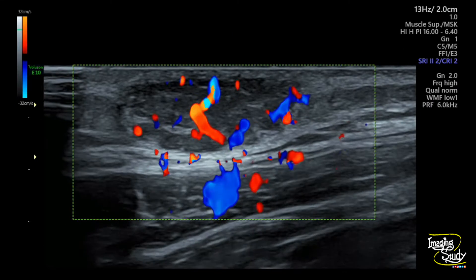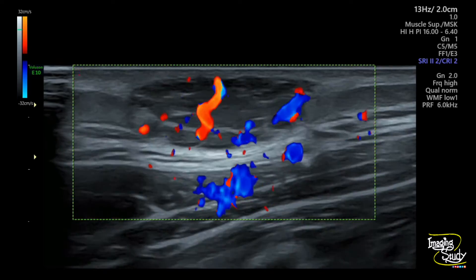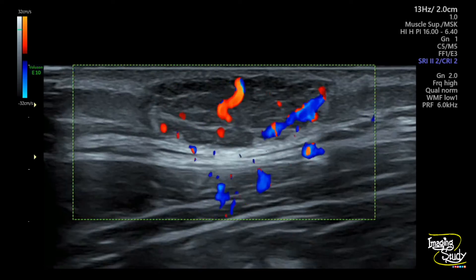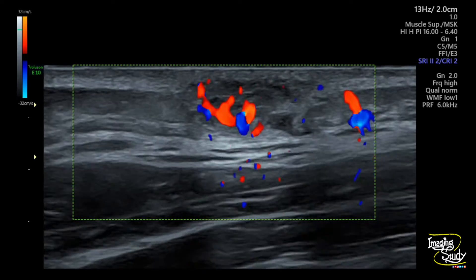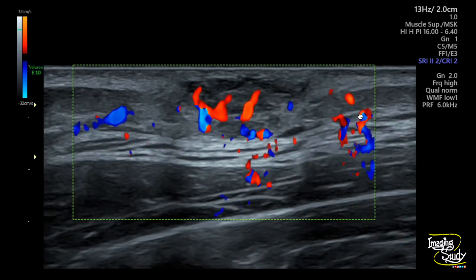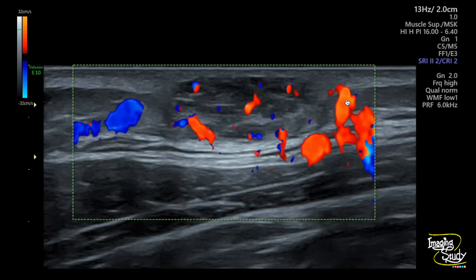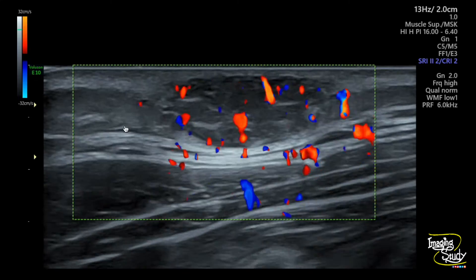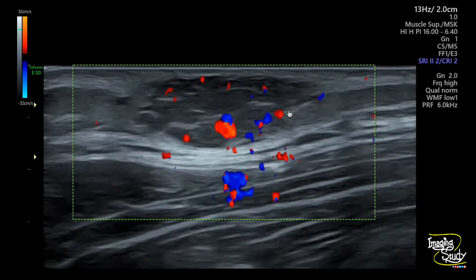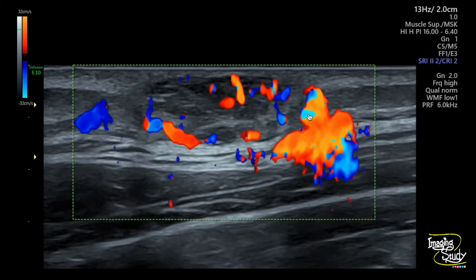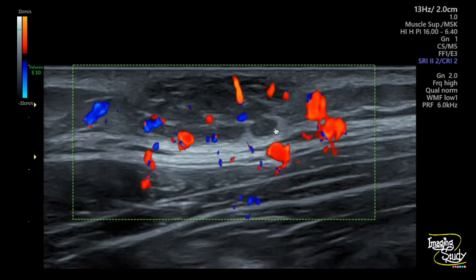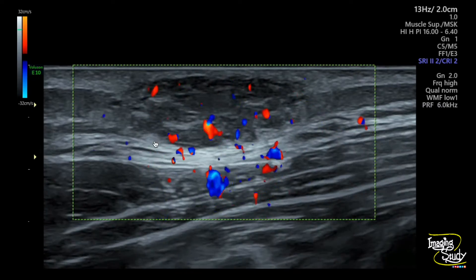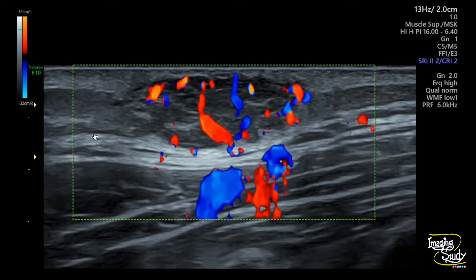Here is the color Doppler picture. I have adjusted it a little, and you can see it is a highly vascular lesion. The feeding vessels are coming from the chest wall vessels. You can see the arterial and venous flow, which can be differentiated by looking at the pulsations.